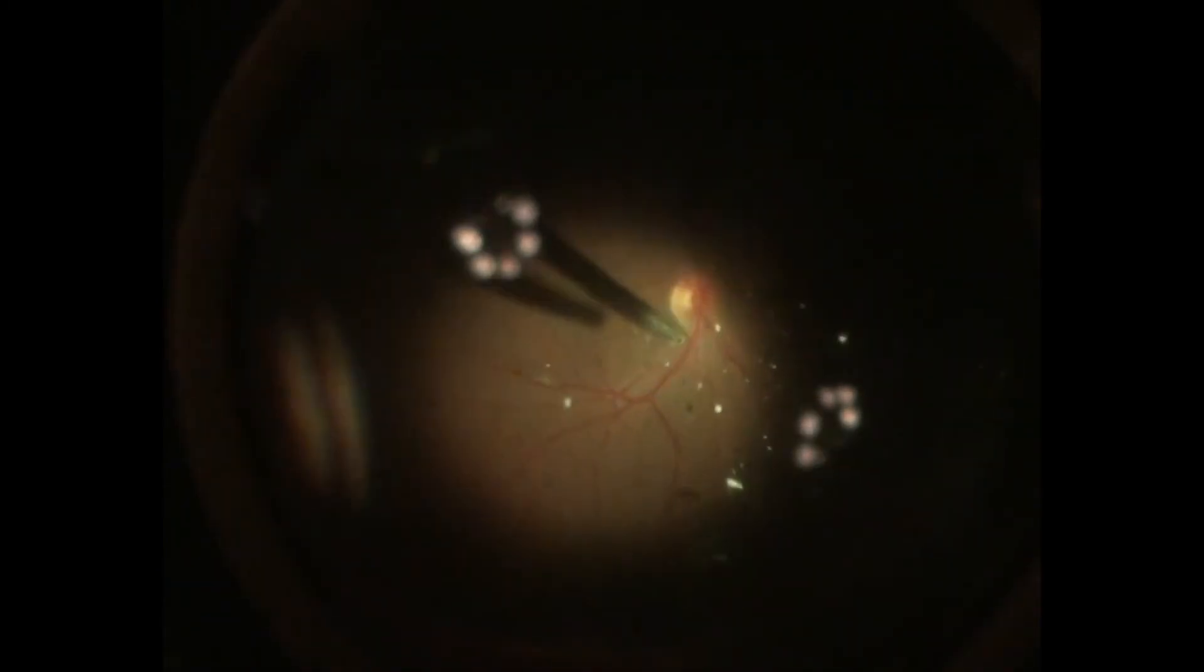At the end of the surgery, the eye is filled with air. This helps to maintain the shape of the eye and also prevents oozing from the smaller blood vessels.